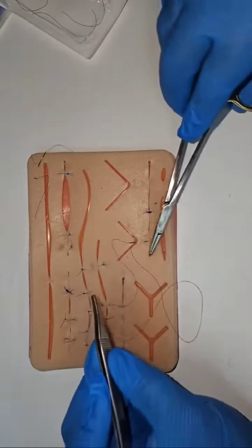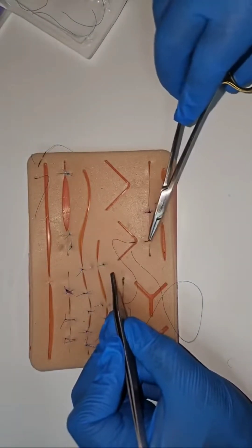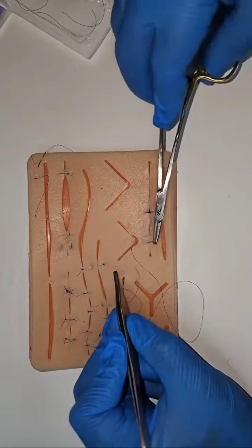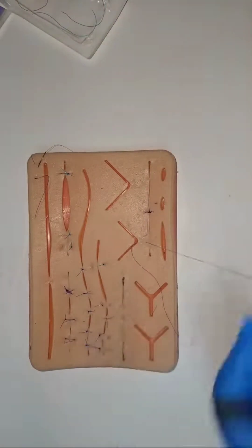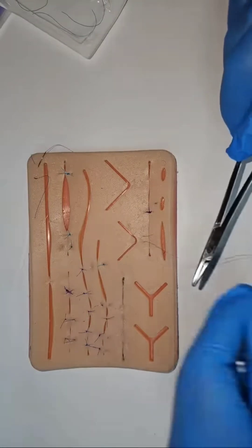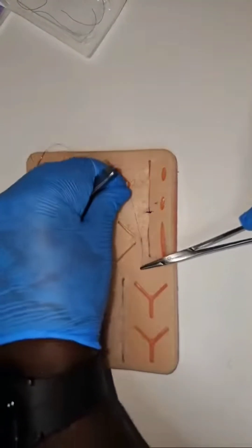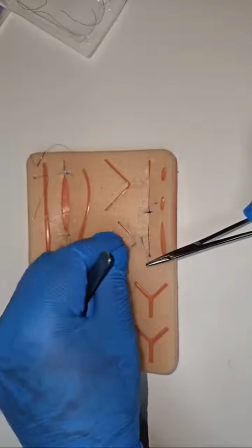It's important to be decisive and anticipatory of what you're going to do next. I'm not handling the needle holder except when I want to do something with it — I'm not remounting it in the air and repositioning it. Everything is intentional, and that's really the key to suturing fast.